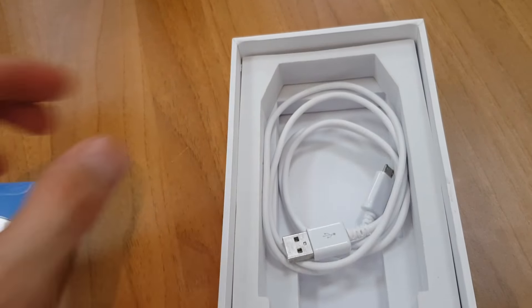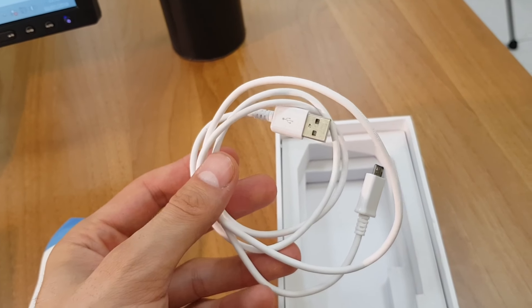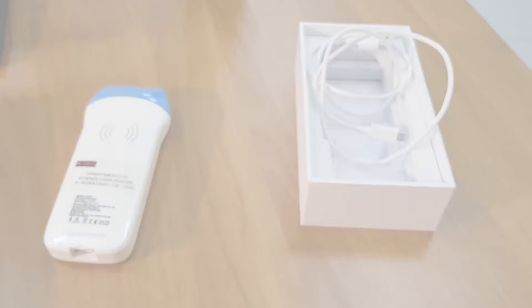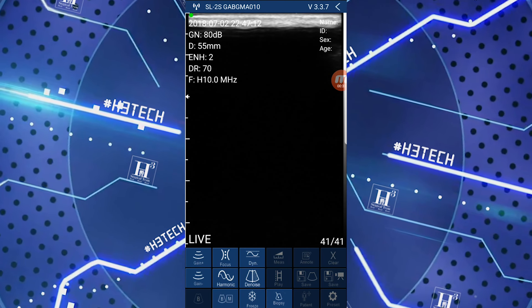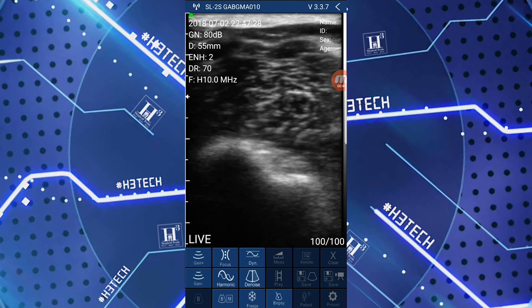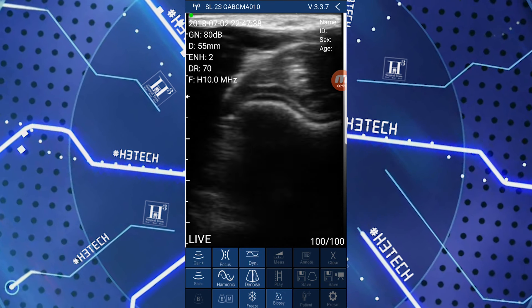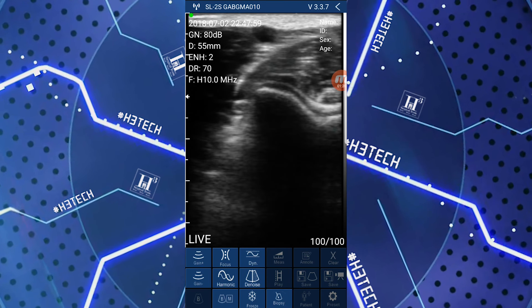And that's everything included. Now let's see the functions in action. This is the main screen of our ecograph and here I'm starting to make it work. I'm placing the ecograph on my left arm. Here we can see the grey area at the top and, going deeper, the various tissue layers below.